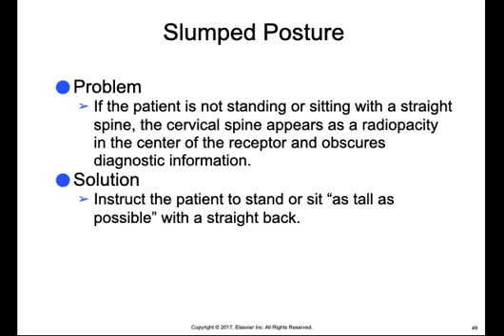A slumped posture is a problem if the patient is not standing or sitting with a straight spine, such that the cervical spine appears as a radiopacity in the center of the receptor and obscures diagnostic information. You'll see a ghost image of that spine right in the center of your image, superimposed on the mid-sagittal plane.